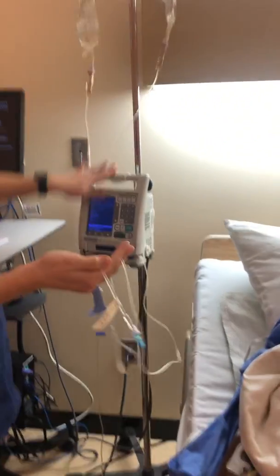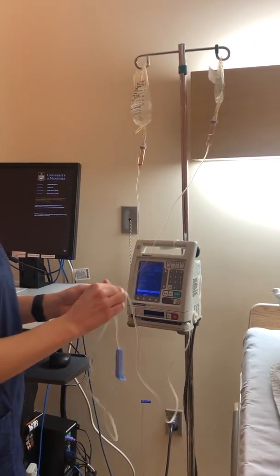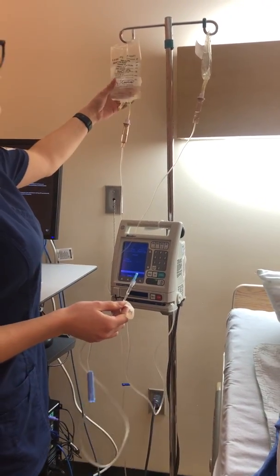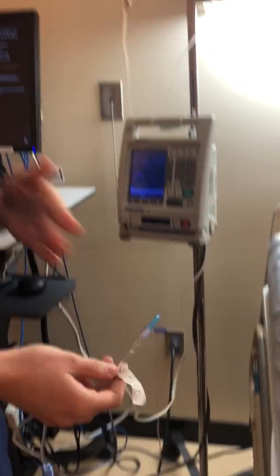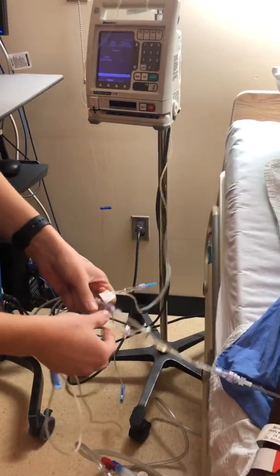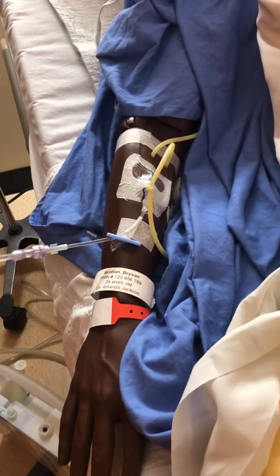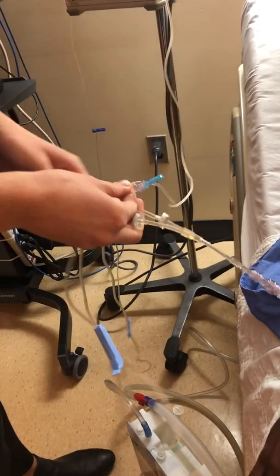The other nurses have primed the line, so there's no bubbles here, and the line is labeled with insulin. We have normal saline, which is compatible, running as a carrier TKO to the patient as well. And the Y site here has already been primed. It's attached. I've looked at the IV site here. It looks good. It's patent. We've flushed it and assessed it already.